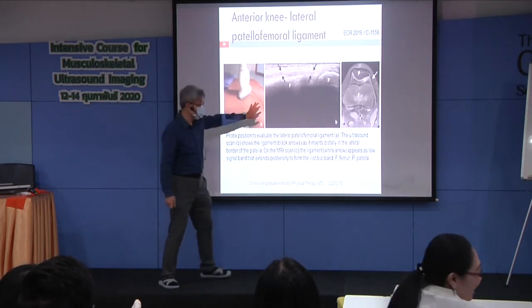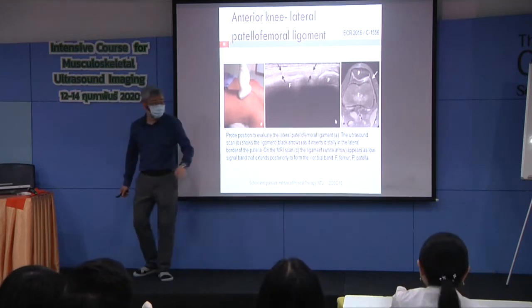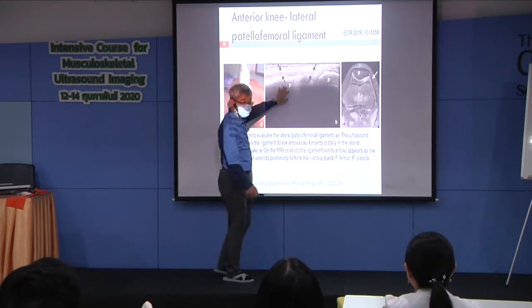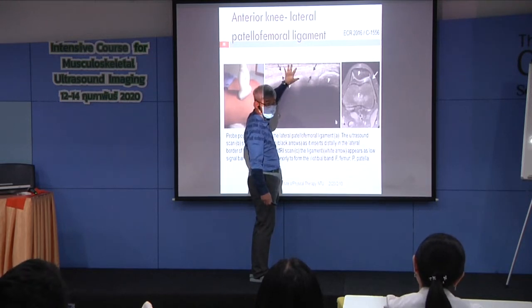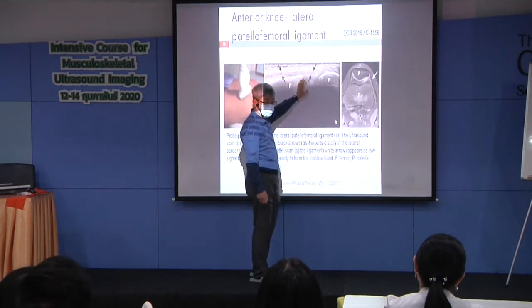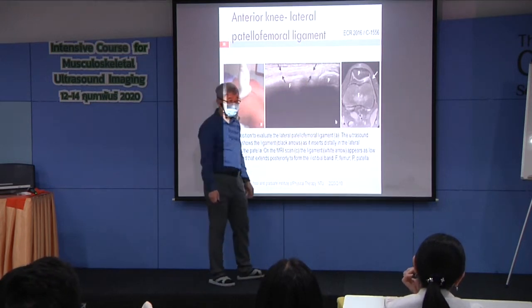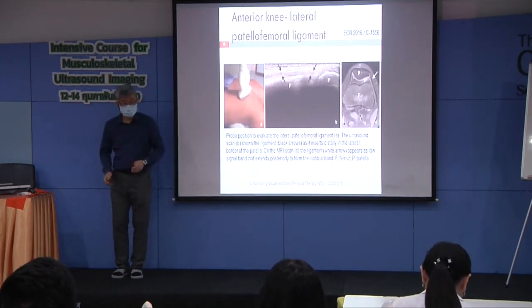Okay, but this is very important. Remember that. If your older patient shows a thickened, swollen and hypoechoic patellofemoral ligament, they have a problem of knee instability, at least patellar instability.